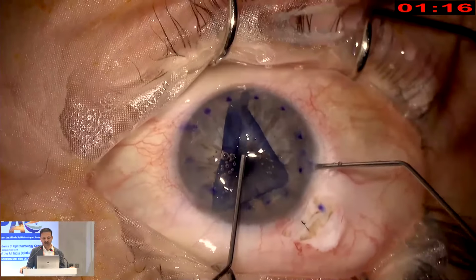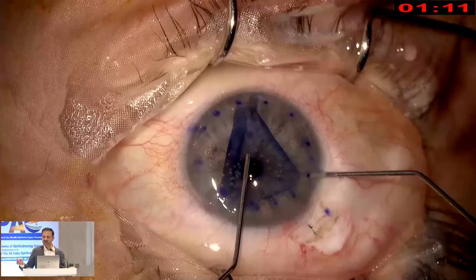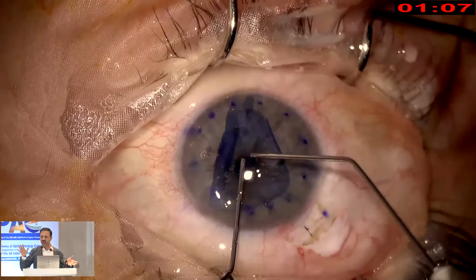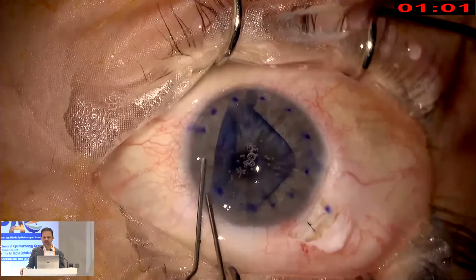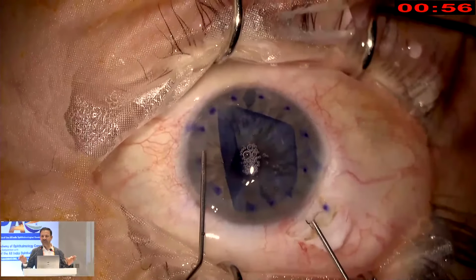Now you see that once it is in the desired position, the first thing you do is, don't start tapping. Release fluid from the side port to shallow the chamber so that your tapping does not cause it to shift from its position. And once it is done, you can stabilize with one cannula, and the other one you can use to tap. And don't use violence. There are always gentle movements.